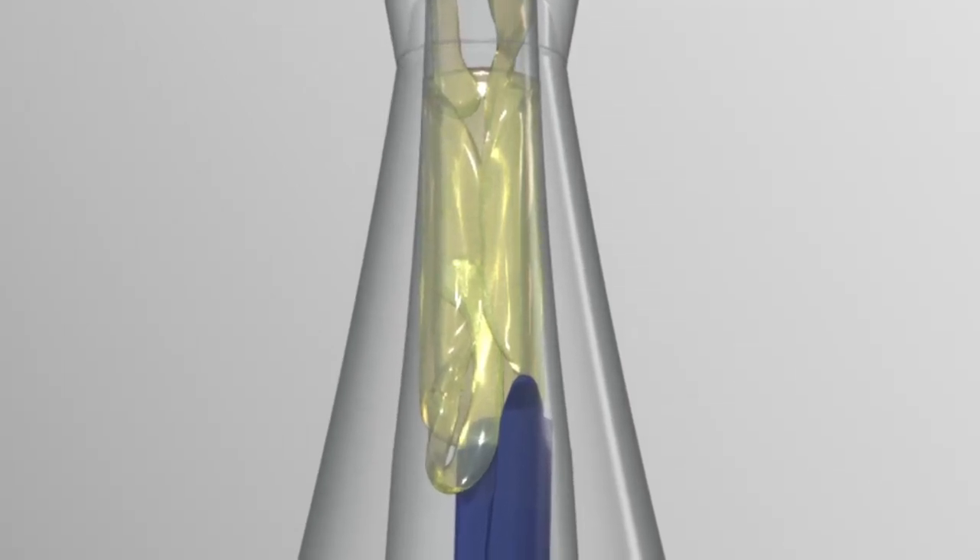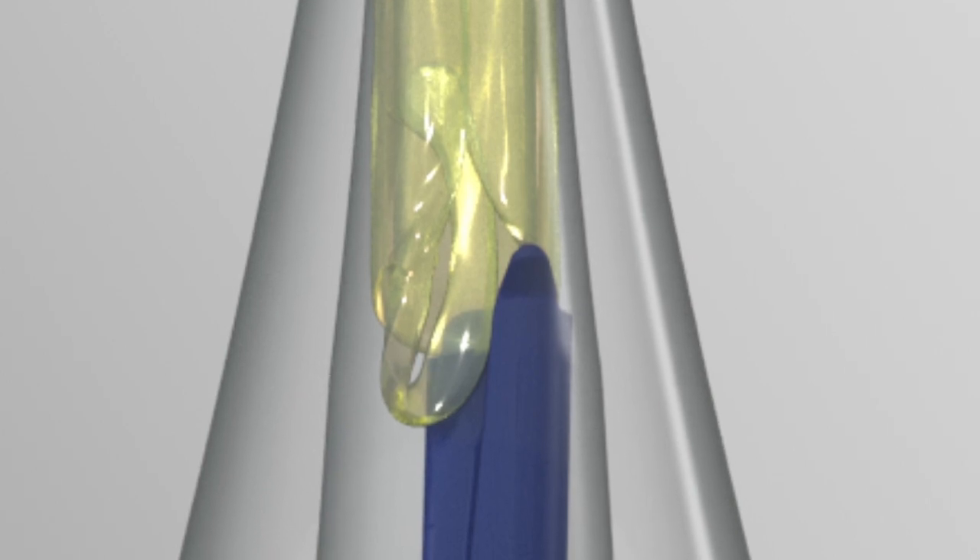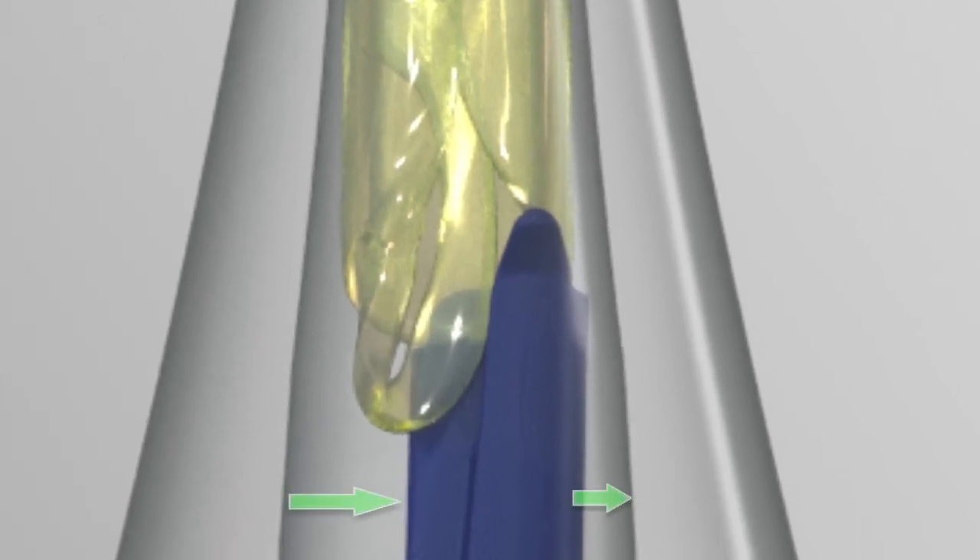Note the plunger tip is in contact with the trailing optic edge to ensure that the trailing haptic is folded in one of the normal orientations. Since a portion of the trailing haptic is always behind the optic and to the left of the plunger, the plunger is pushed slightly to the right. All of this is normal.